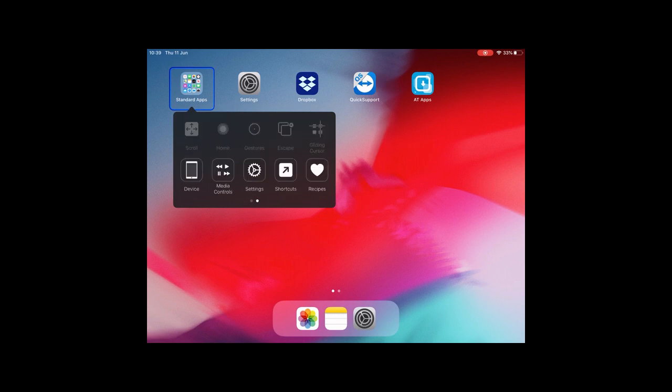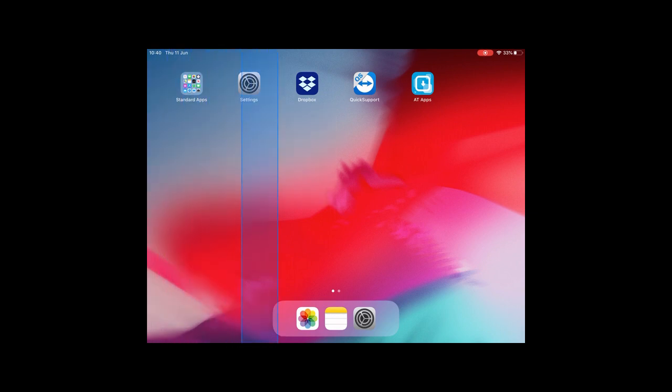On the second page, you'll see the gliding cursor in the top right corner of the scanning menu. So we are going to use the switch, scan through until we get to gliding cursor in the top right corner, select that with the switch, and now that has turned on the point scan. So this gliding cursor, as you can see here in blue, moves side to side. To select an item on the screen this time, you wait until the cursor is highlighting an area, and then you press the switch.